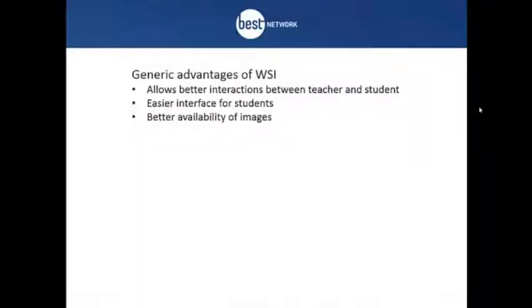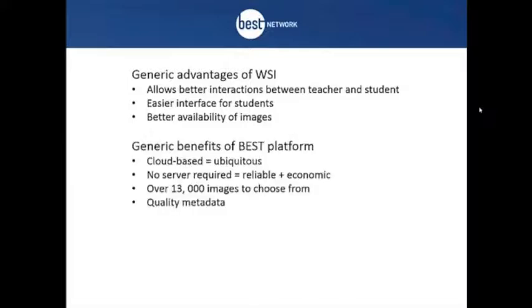Thanks, Danny. I see a number of advantages for using Slice, and obviously we have to put that in the context of talking about whole slide images. It's been known for a long time that whole slide images have a number of advantages. Easier for students to interact with teachers, easier interface for students, etc.